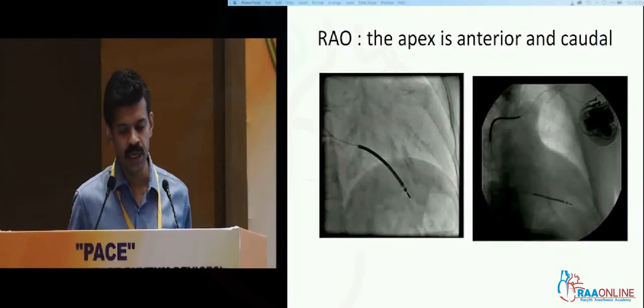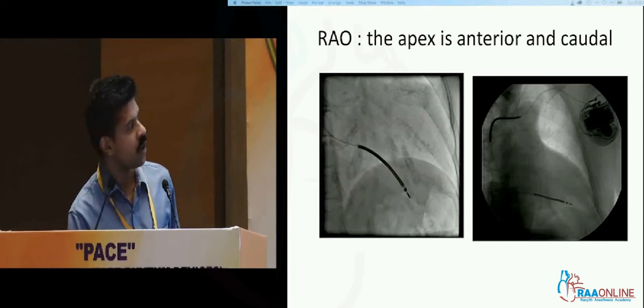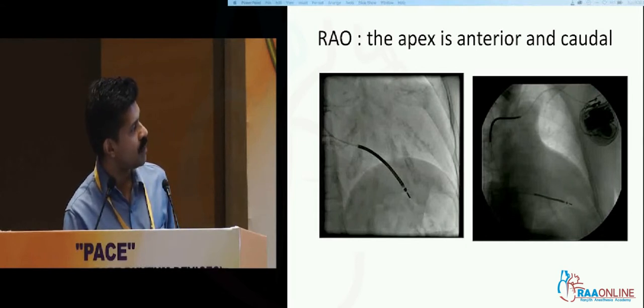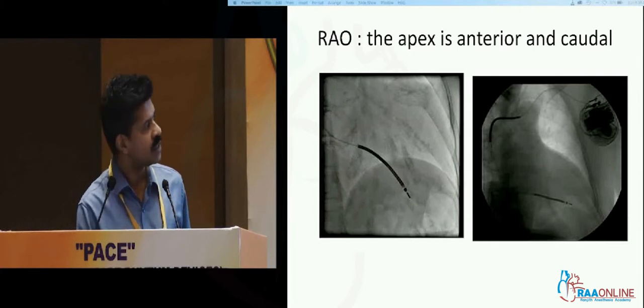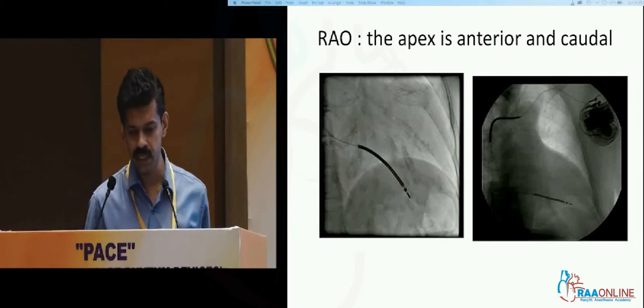The second point: in the right anterior oblique view, the apex is anterior and caudal. This lead is caudal but not at all anterior; this lead is anterior and reasonably caudal. So this one is near the apex, and this one is nowhere near the apex.